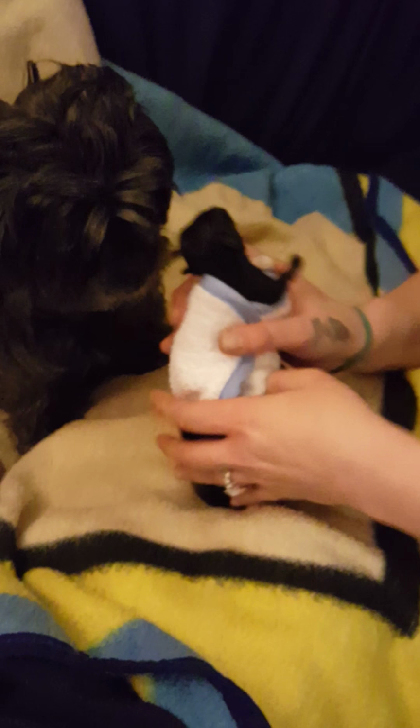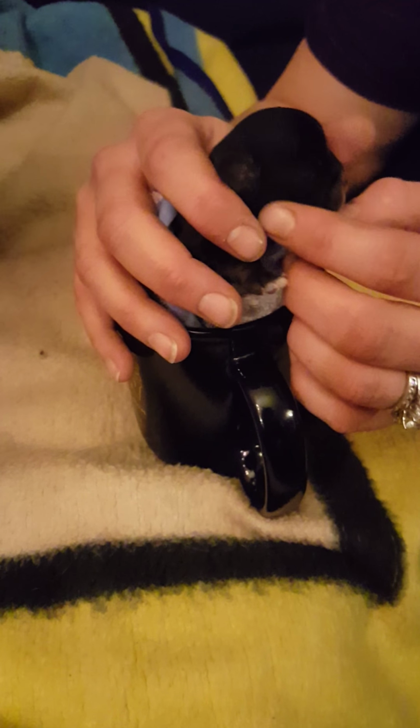Here, you take that. And one of the ways to keep them from wiggling around too much, okay, sit down, Jin, is you put the little tiny itself in a little cup so that they don't wiggle around too much while you're trying to feed them. So, Jin, you sit there for a second. Don't pick her up. I'll keep her with me until I get everything ready. So keep that on Jin and the puppy.